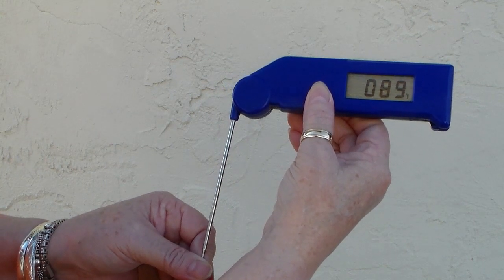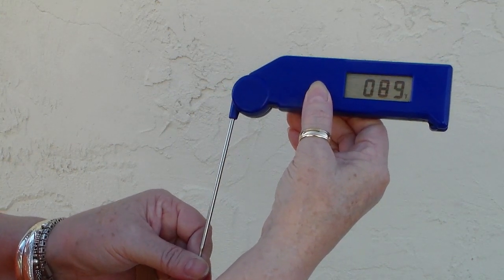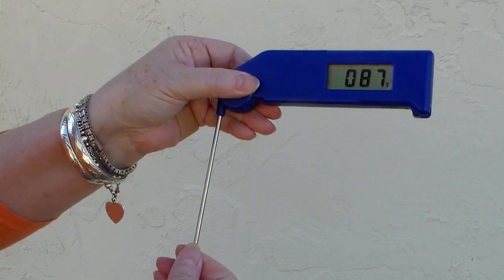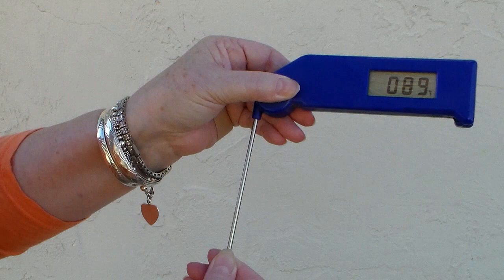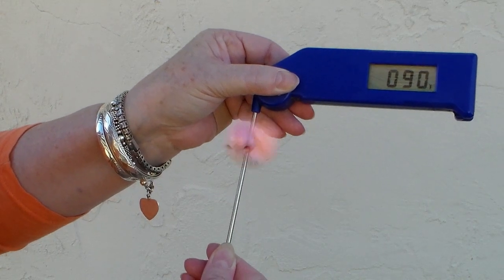But mine was about 68 degrees, so that's still like a 20 degree difference. Yeah, actually my left arm is hurting me right now too, so that's pretty interesting. My hands are colder, more than 20 degrees colder than a normal person's at times.